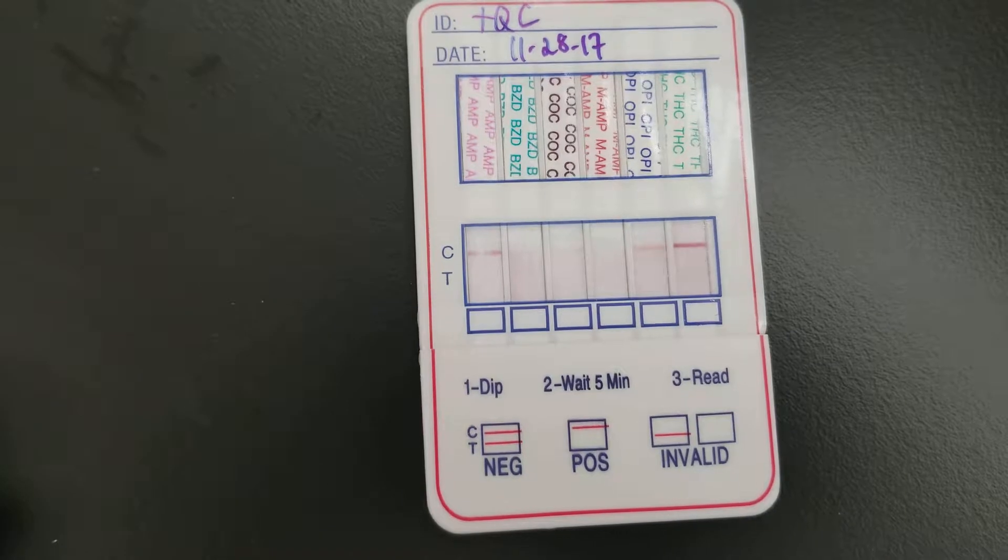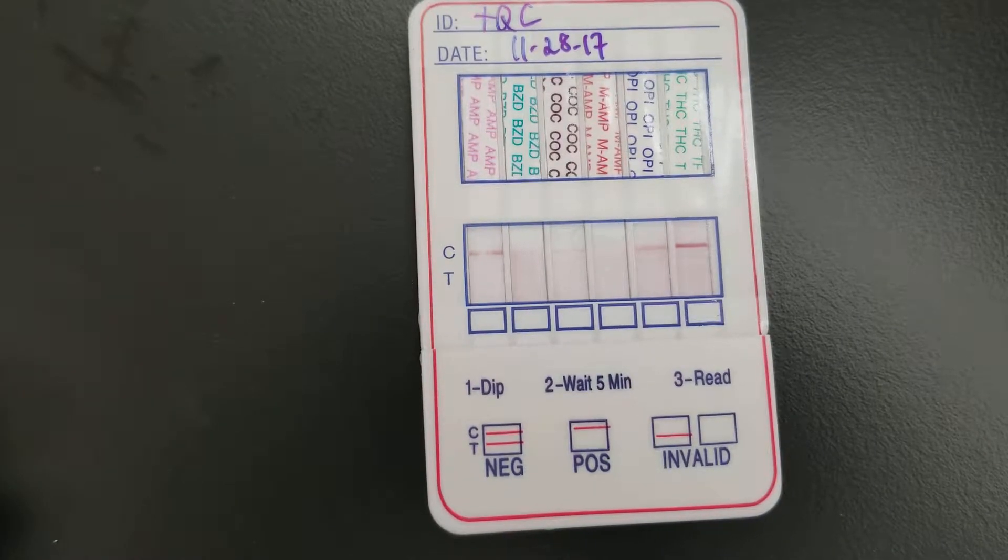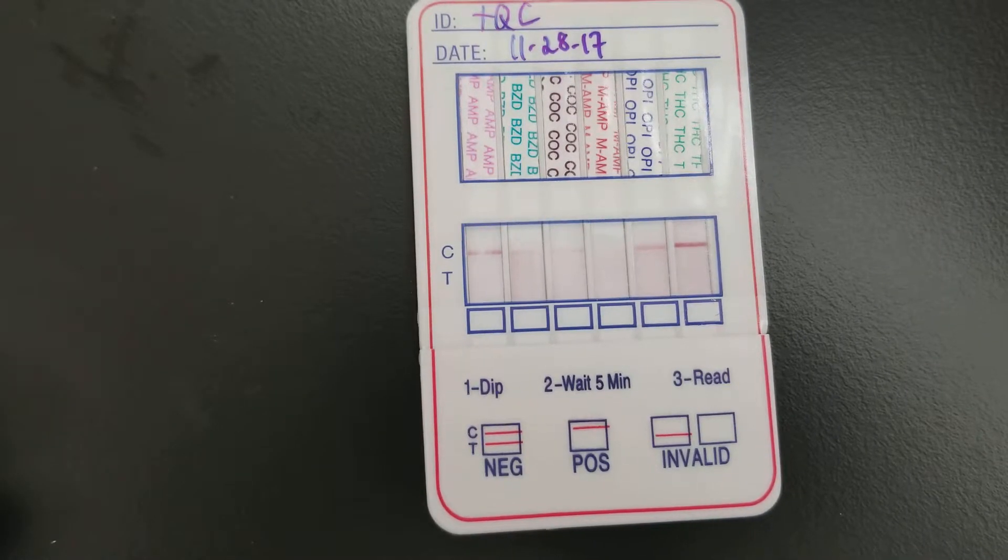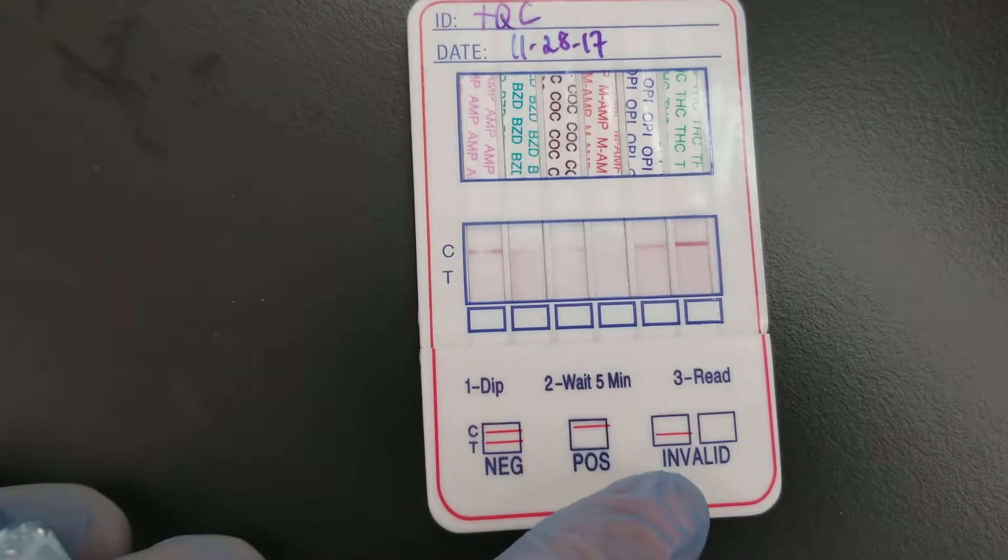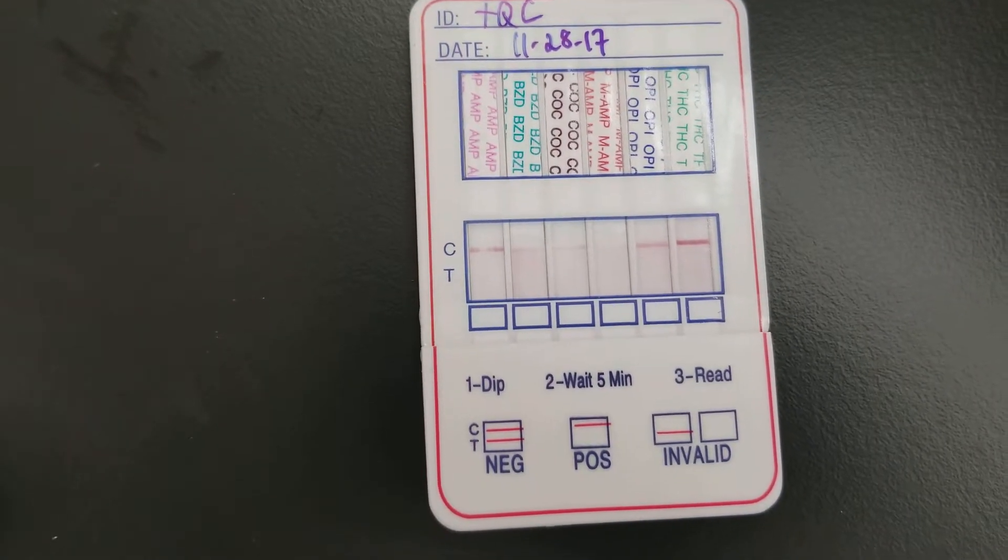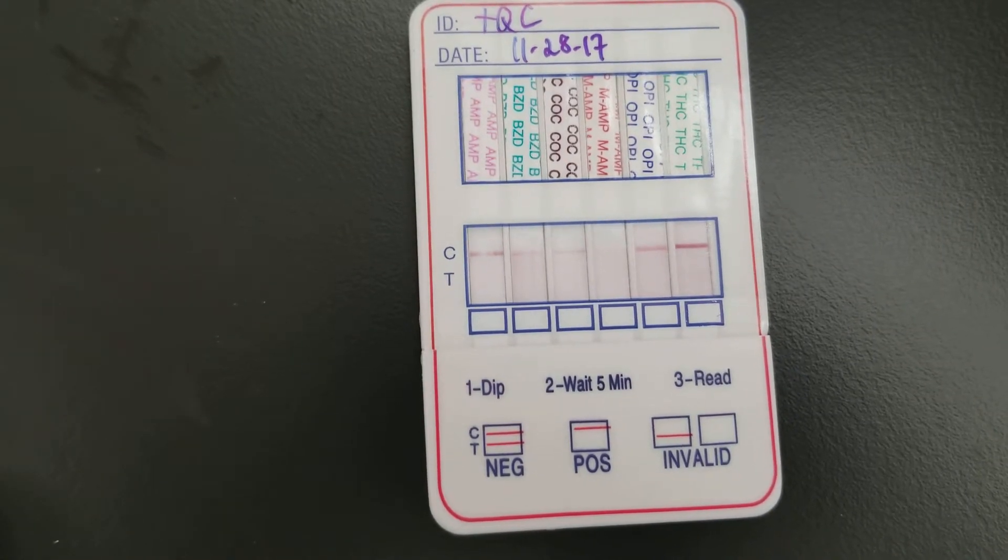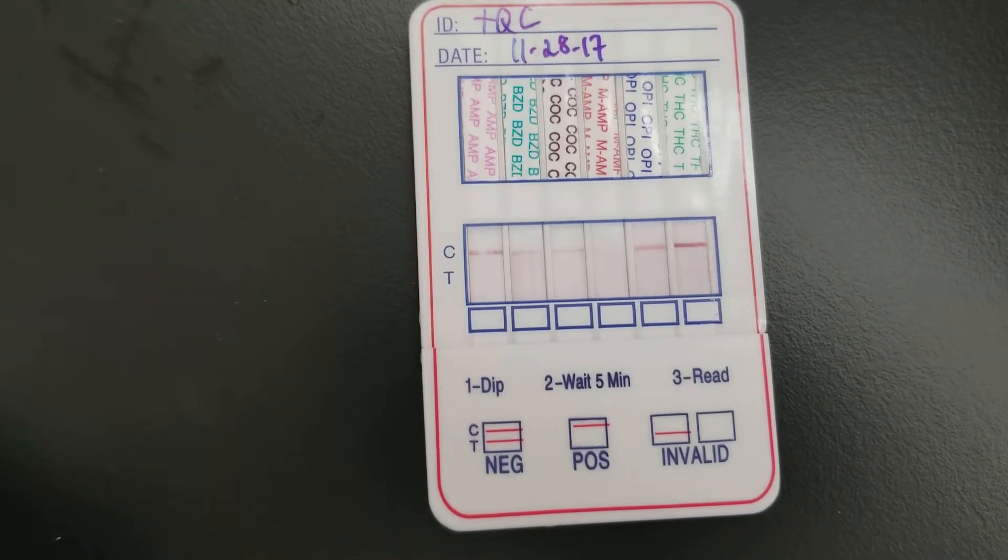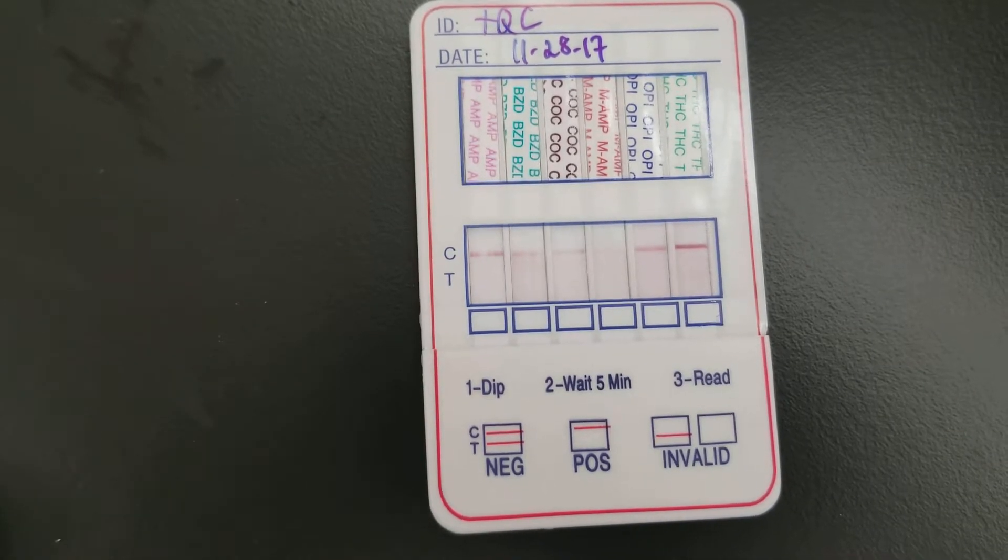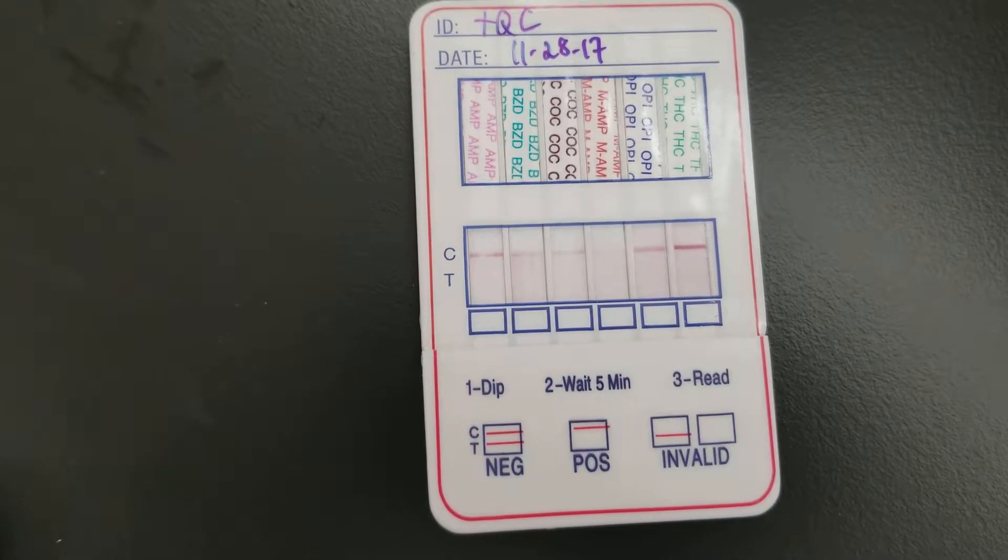If it's just the test line, that means it's invalid. You would then have to do it again from the same lot. And if that still doesn't work out as expected, you would go to a different lot and perform your QC.